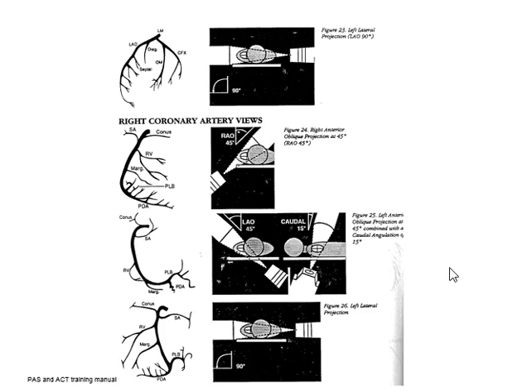This slide shows more views. I won't go through it. We won't extend this lecture more than we have to. But again, it shows you diagrammatically how the vessels lie in relation to each other with different angulation points.